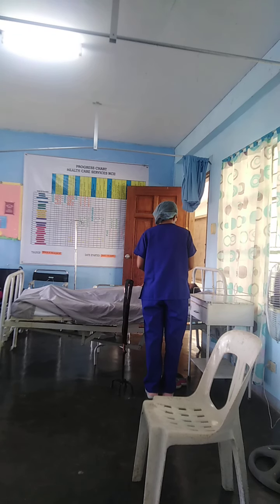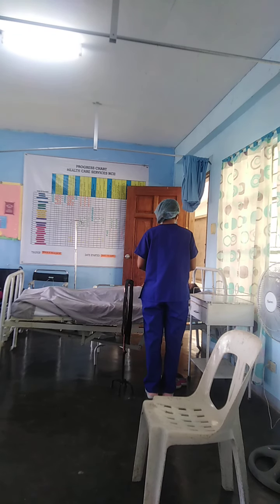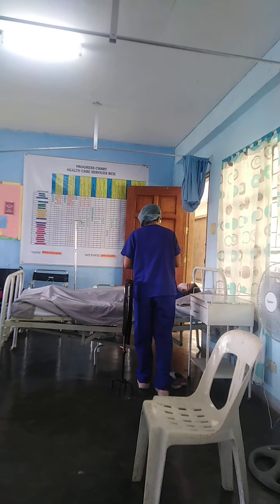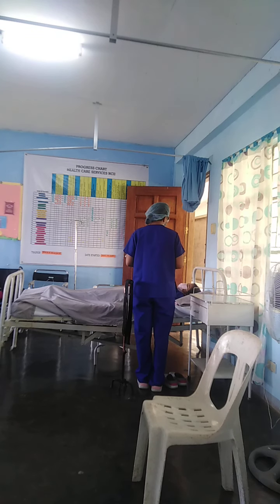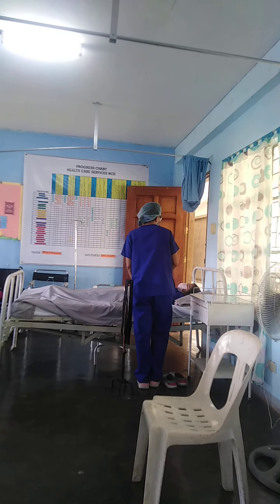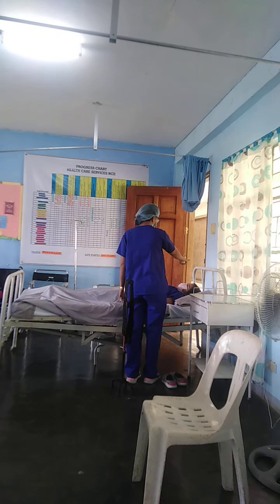Feeling po ba kayong maglakad, ma'am? Wala na yung kaparamdaman na ilokong ba kayo? Sabi lang po kung ilan po.